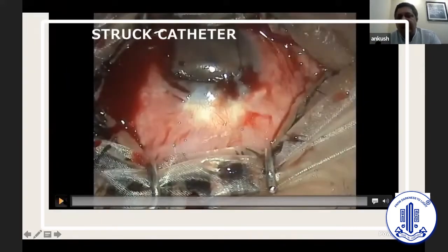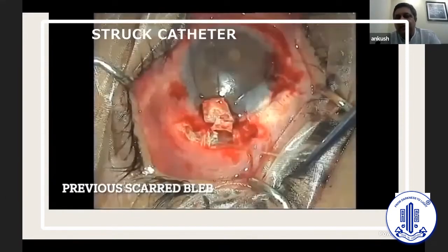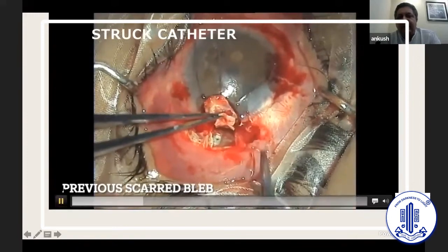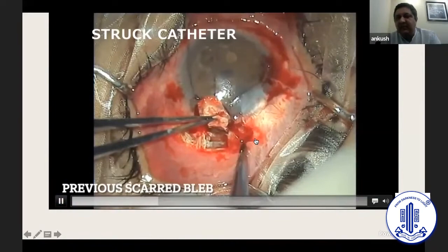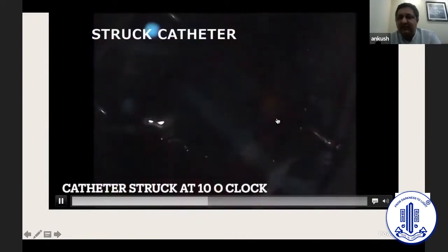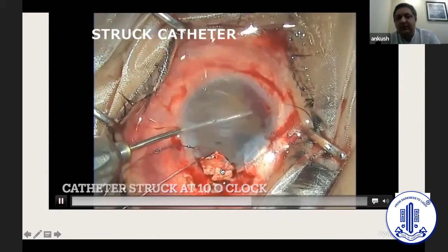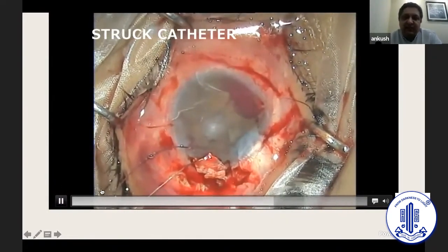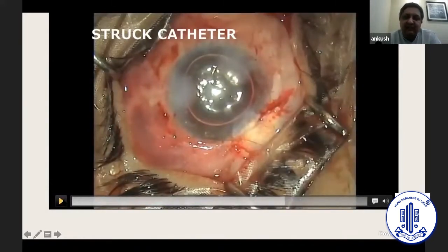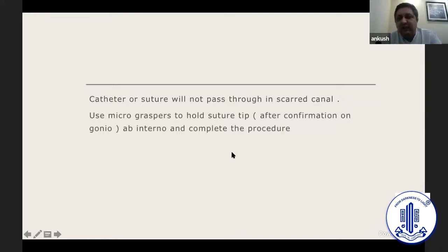People are doing a lot of GATT procedures these days, and because most don't have access to a catheter, they use 5-0 prolene sutures. These sutures can get stuck sometimes. It's important to anticipate why. In this case there was a previous scarred bleb, so I anticipated the catheter would get stuck there — and it did. What I did was make a small side port, go in through micro forceps, open the jaws in the angle, grasp the catheter, and pull it out. If you are doing a GATT procedure with a suture and it cannot pass 360 degrees, use a gonio lens, check where the tip of the suture is lying, make a side port opposite to that tip, go in with micro forceps, hold it, and complete the procedure without abandoning it.